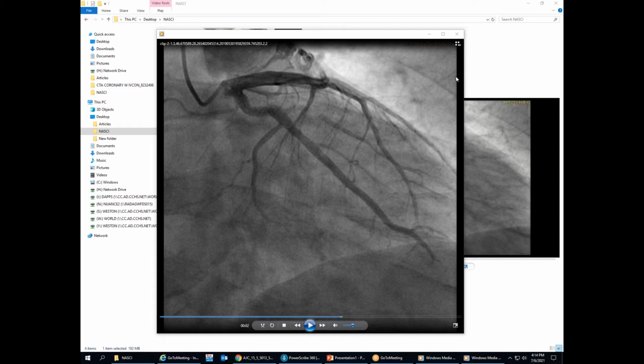Okay, I can try to start. Just I wanna get just a couple things clarified. Number one is this was a finding on CT, not on MRI, correct? Correct. And this is a patient where you found also that there was a dilated left ventricle. So there is a non-ischemic cardiomyopathy going on. So the assumption was when the patient was referred that this is ischemic. It's just that we get something to suggest that this is ischemic. Okay. All right.